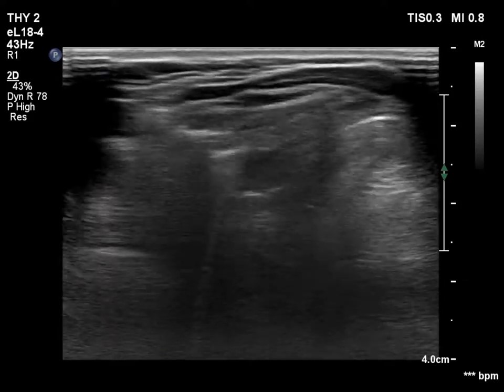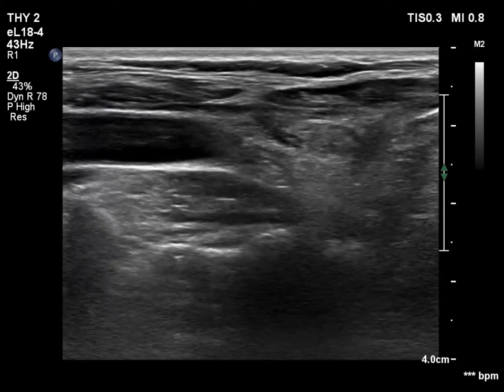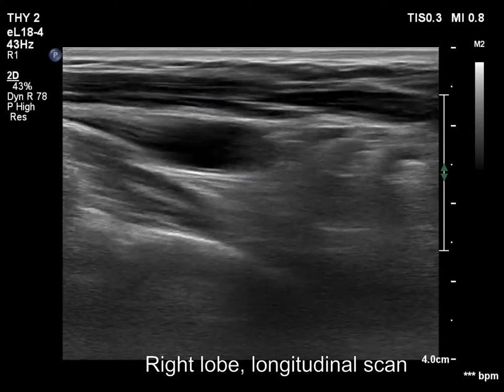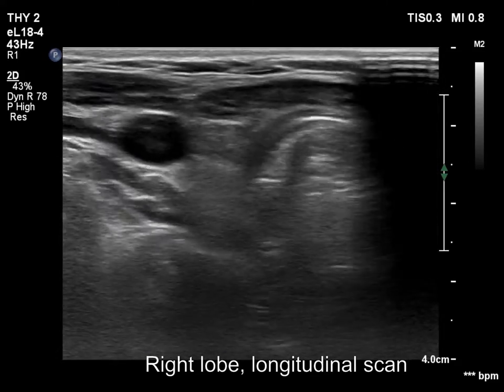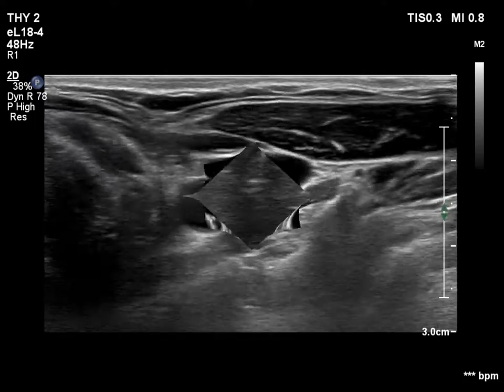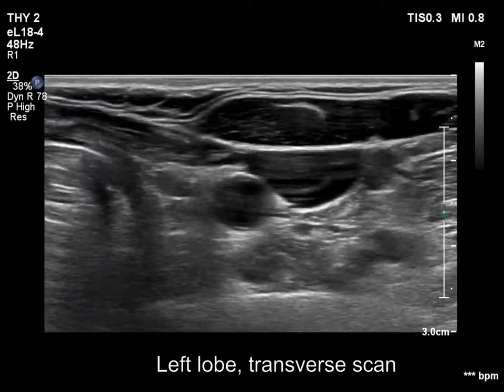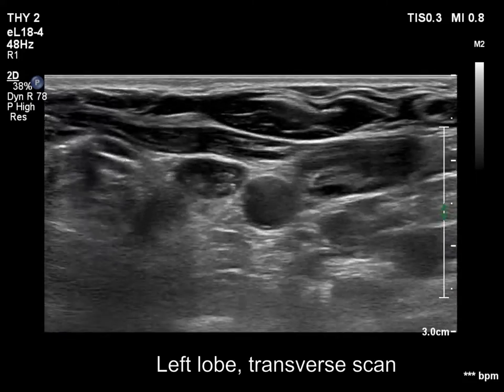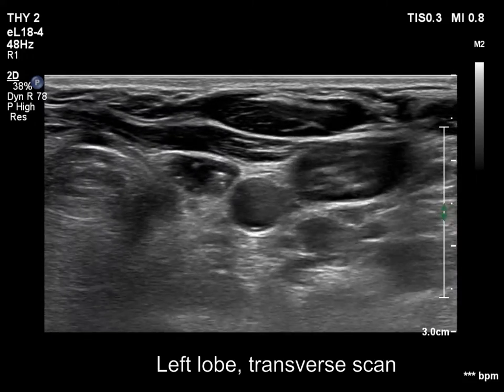There is no thyroid tissue according to the right lobe. Mostly connective tissue has replaced the thyroid. There was a cystic mass surrounded with connective tissue in the left thyroid bed.